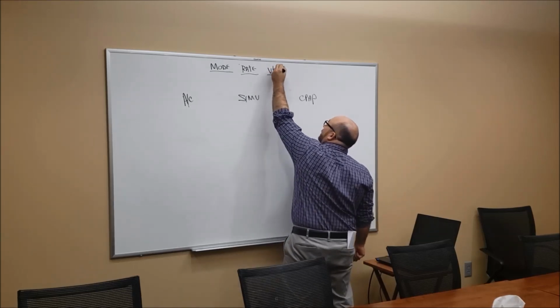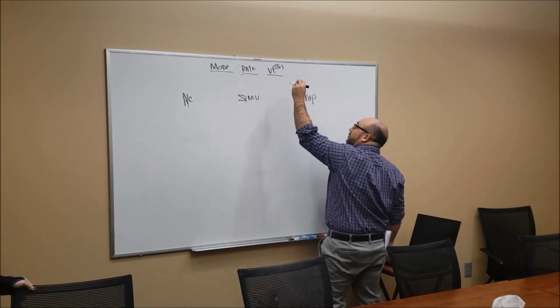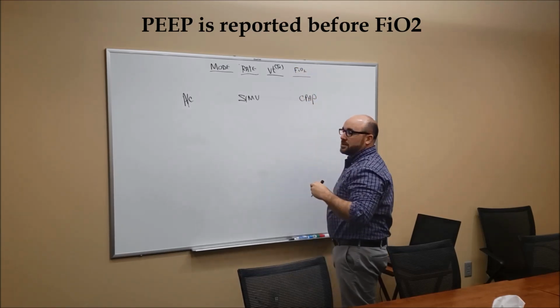Some people call it TV. I don't like that, whatever. So: mode, rate, tidal volume, and FiO2. Does everybody remember what FiO2 stands for?